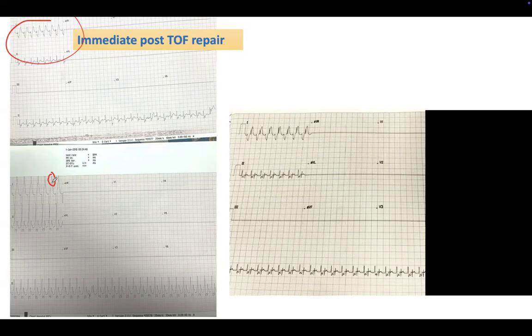So it could be sinus tachycardia, or it could be just junctional with retrograde P wave. You cannot tell because the atrial signal is not P waves on your ECG, it's just atrial signal. So at least you ruled out flutter, for example.